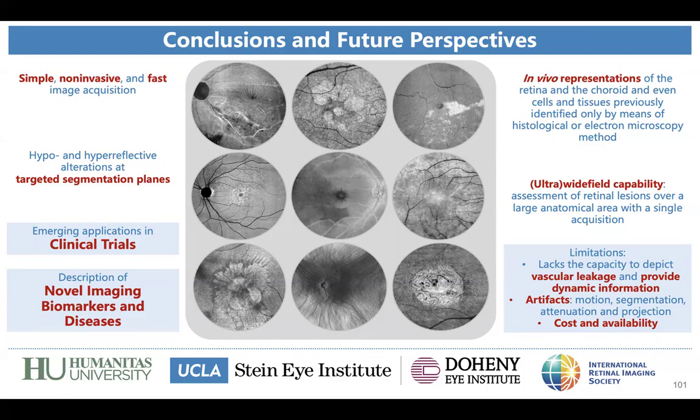I think this is a very important limitation also for research and original studies, because it's difficult to collaborate with other centers that have different devices. And so it's difficult to acquire and collect data, for example, on geographic atrophy or hypertransmission defects or drusen volume and so on, in terms of using different devices across different centers. That's why standardization in this field is so important. So yeah, absolutely, it's a very important observation.